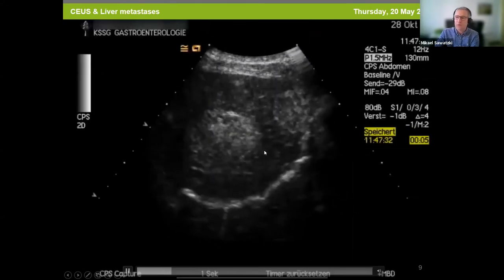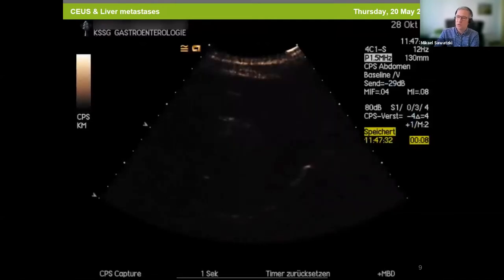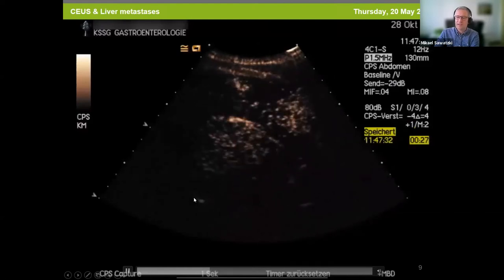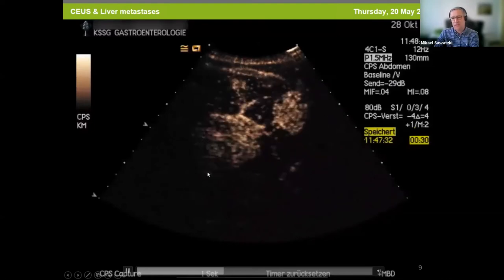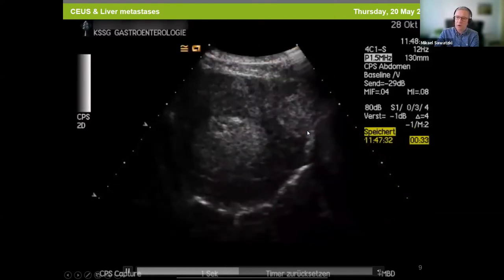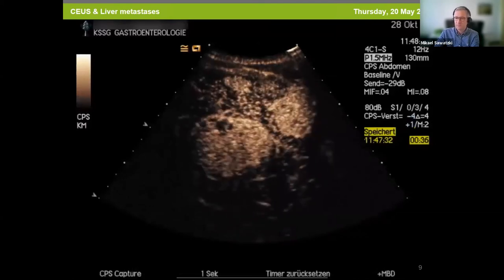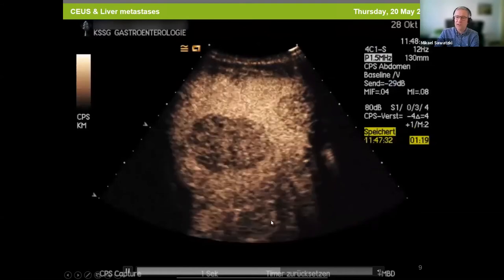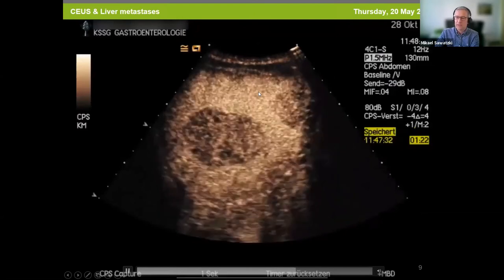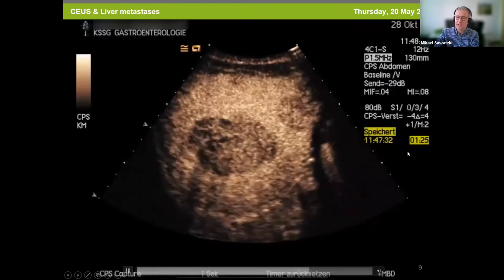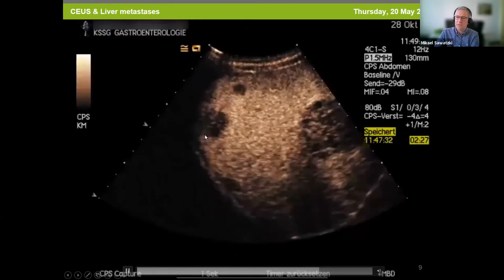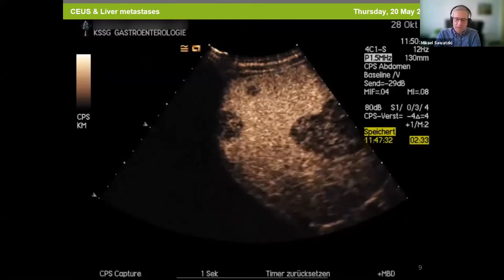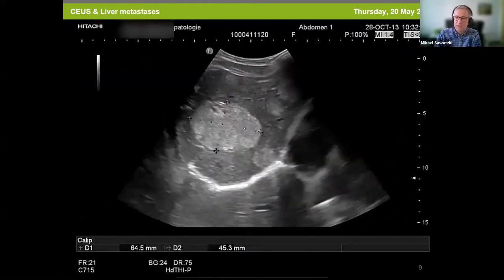No risk factors, but a 60-year-old patient. You see the image 2 seconds after injection of 1.5 mL SonoVue, showing nonspecific contrast enhancement in the arterial phase in all liver lesions. After 1 minute 15 seconds in the portal venous phase, you can recognize all lesions with washout — a typical marked washout for liver metastasis. This was a patient with a neuroendocrine carcinoma.